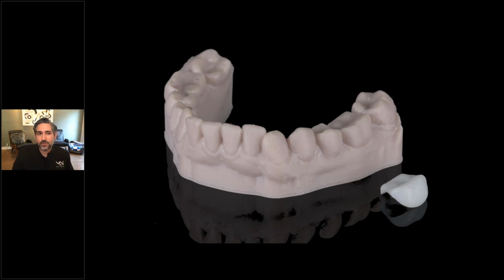And it's important to note that my normal routine would be to use a pre-op silicone matrix, but now with all these technologies, when I see the opportunity, we're trying to get scans ahead of time and prepare for these situations, because I much prefer this rather than trying to improvise and make a provisional during the procedure. Saves us a lot of time, makes the procedure run smoother. So I plan on doing a whole lot more of these provisional shells like this.